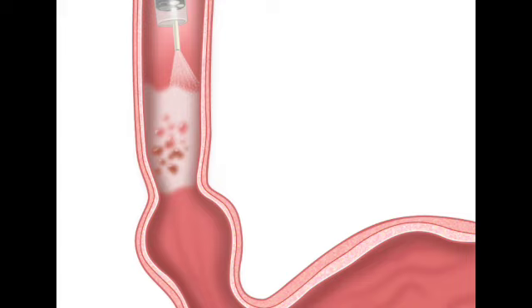What kind of reaction? Well, the healthy tissue, the tissue without any neoplastic or cancerous changes, reacts to the acid by turning completely white. Wait, really? It just changes color from pink to white. It blanches. Upon contact with the acid, the healthy lining turns an opaque white. Okay, here's where it gets really interesting to me. Because normally we expect the quote-unquote bad stuff to turn a weird color to stand out. Oh, like a dye. Yeah, think about those plaque-revealing mouthwashes you use at the dentist. Oh, right. Your healthy teeth stay white, but the plaque turns bright purple. But here, the healthy tissue is the part that puts on a white disguise.